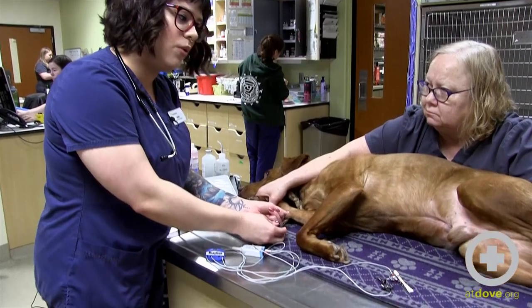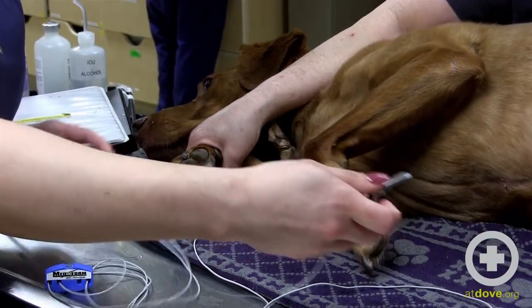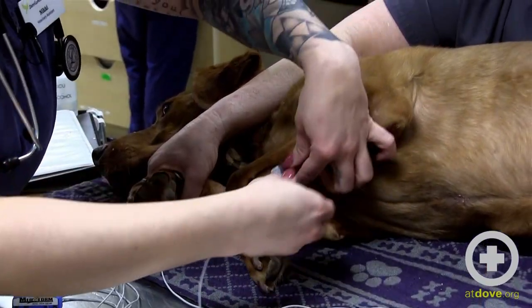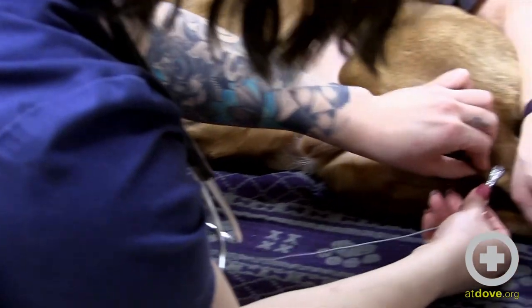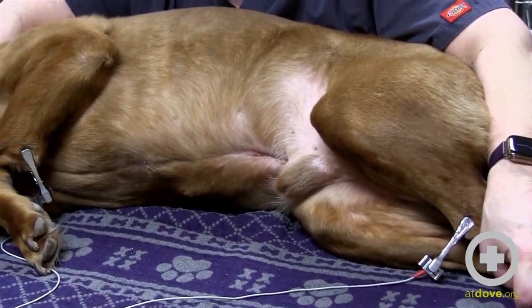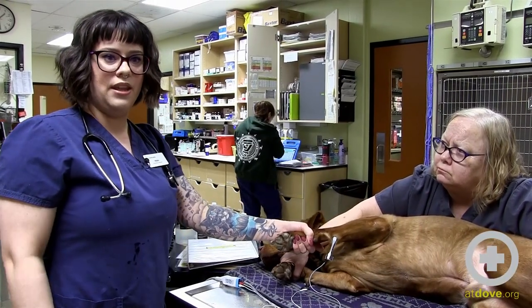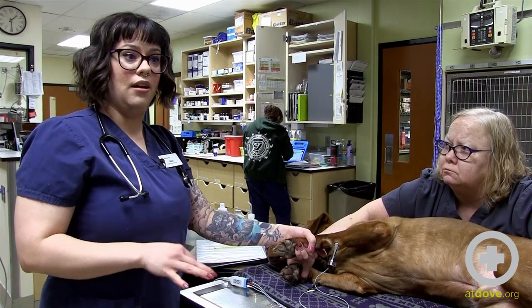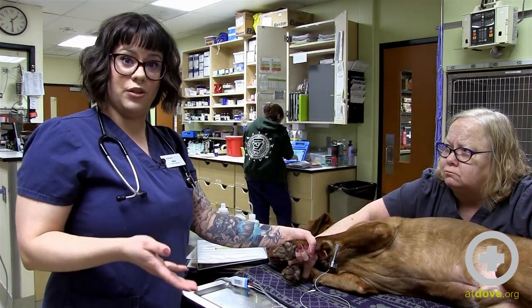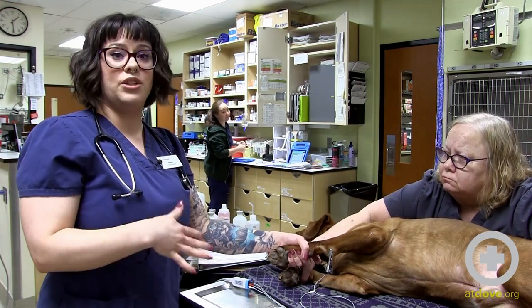I like to place lower on the limb, kind of distally, because I feel like you get less interference that way — if they're panting or making sounds, you don't hear it as well. Before applying alcohol to these leads, I'm going to turn on my machine and see if it's actually necessary. I don't want alcohol to be my first go-to because if this is an emergency situation and the patient needs to be defibrillated, you do have a risk of a fire hazard with alcohol on the patient. So I always like to keep that in the back of my mind and make it a habit, even in non-emergent situations.